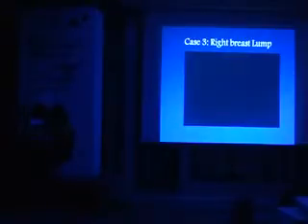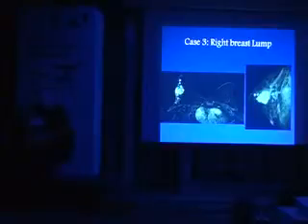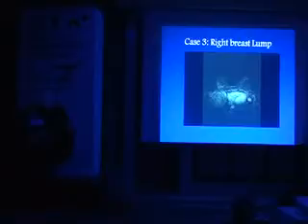Okay, case number 3, right breast lump. We have a video here. Sorry. It's not working or what? Okay, this is the video.